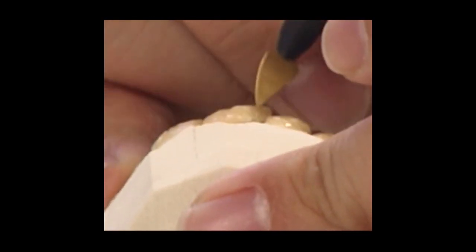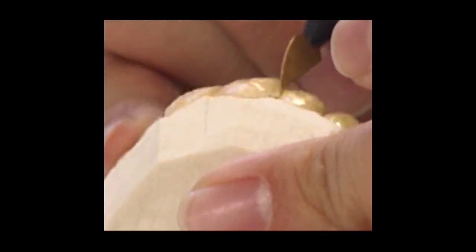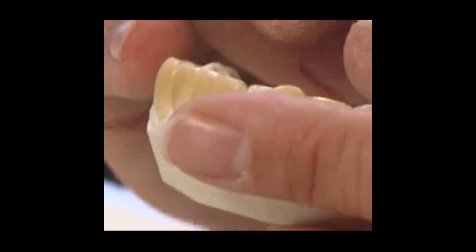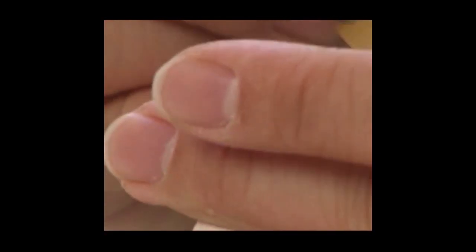If you make it too small or too accurate, you wind up adding more, because the patient could say that it's too small or it's too short. Then it's a hassle. So better off making it slightly bigger, slightly longer, so you have room to adjust as we need it as it goes by. So we add a little bit more on the mesial. We'll be done.